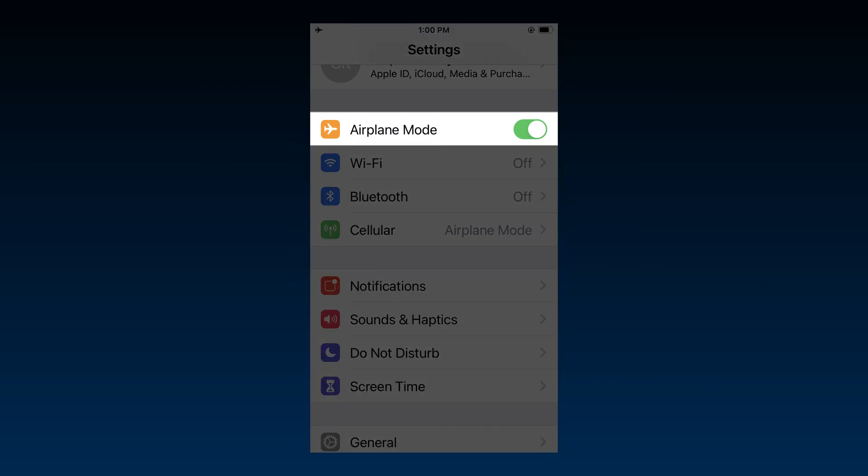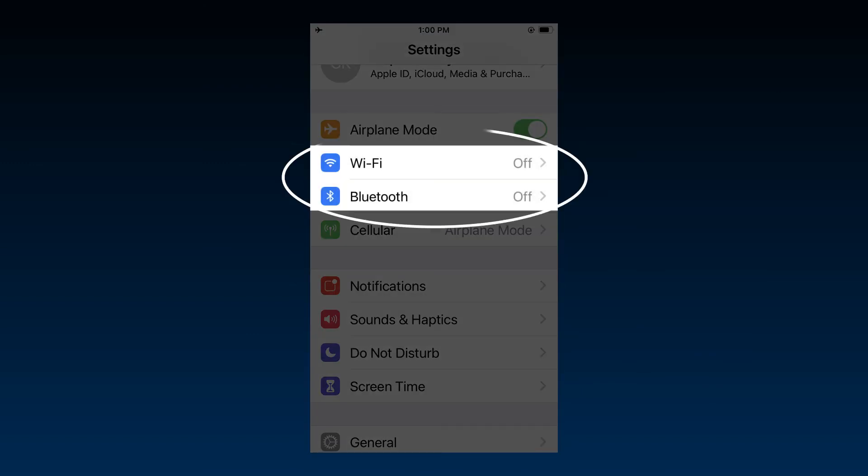If in flight mode, you'll need to manually activate the Wi-Fi and Bluetooth on your display device.